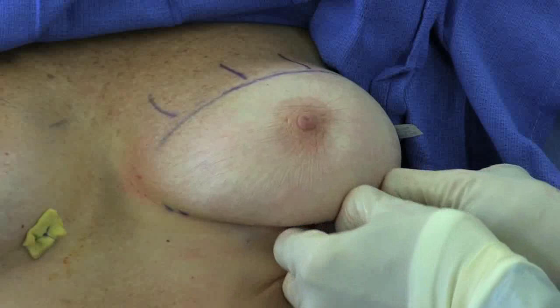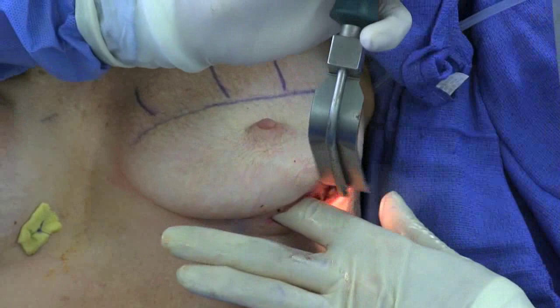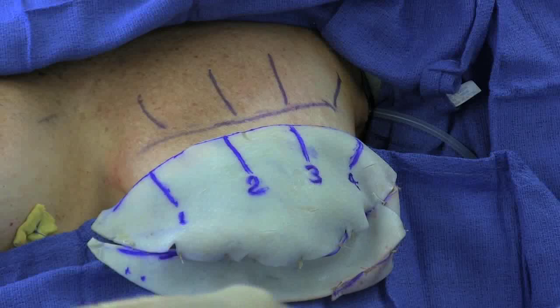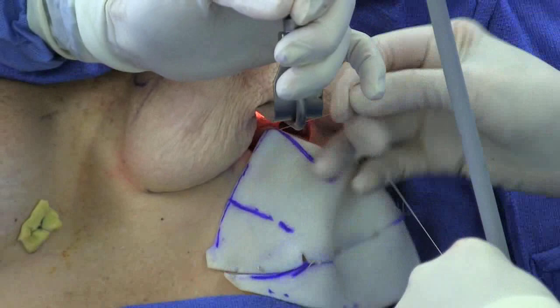The temporary implant is then removed and a drain placed. The ADM is now sutured to the pectoralis muscle at each of the four markings.